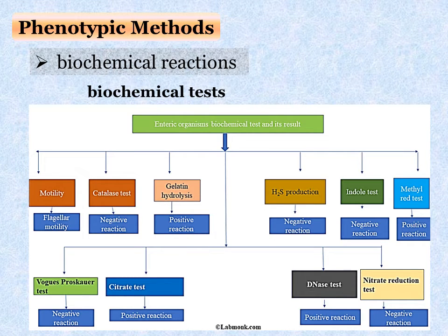Biochemical tests are among the most important methods for microbial identification. Routine biochemical tests include tests for catalase, methyl red, citric acid utilization, and hydrogen sulfide production. Microbial biochemistry tests shorten the time required to identify microbes, reduce cost, and ensure or enhance the accuracy of identification of an unknown sample. It is the fastest developing trend in microbial identification. In recent years, rapid commercial test kits for anaerobic bacteria have become available.